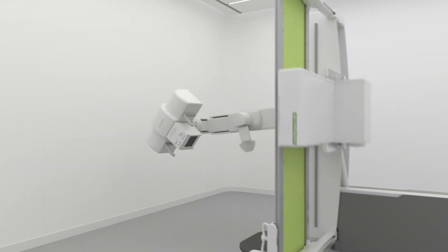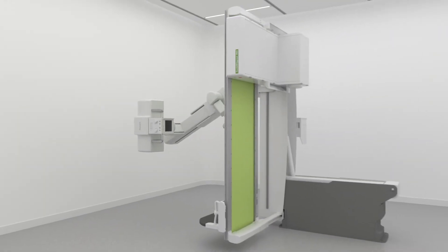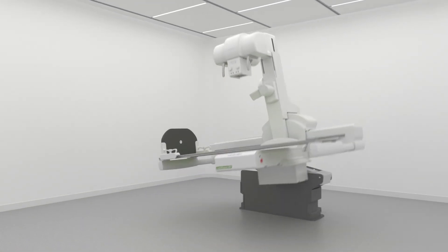All of this can be accomplished without the need of a wall stand or overhead x-ray tube, making it a truly flexible system design.